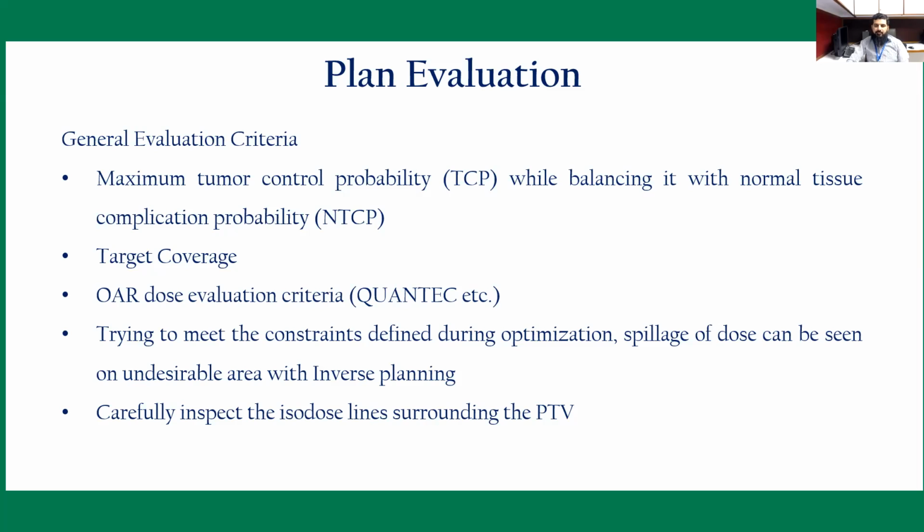You have to look at the slices where the PTV or the normal organs are defined, and also evaluate the beam fluence generated after optimization. Also look at the isodose lines surrounding the PTV, how much coverage your PTV is getting, and what the maximum limit is.